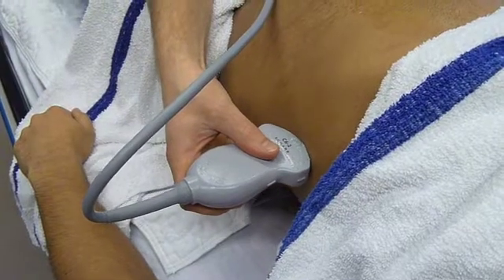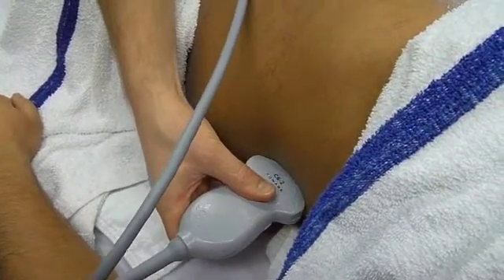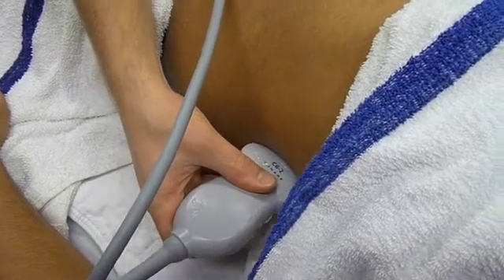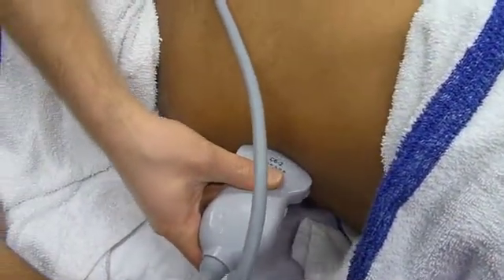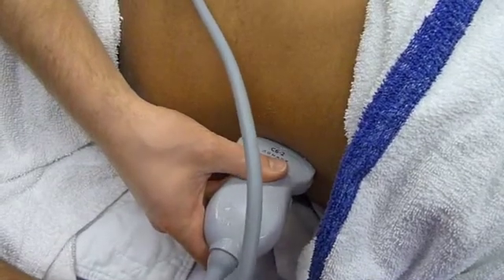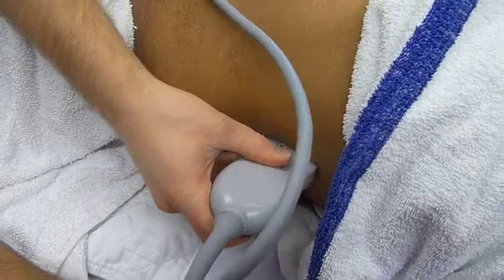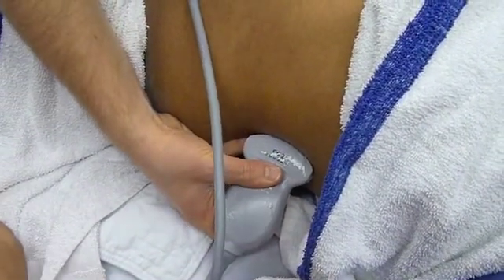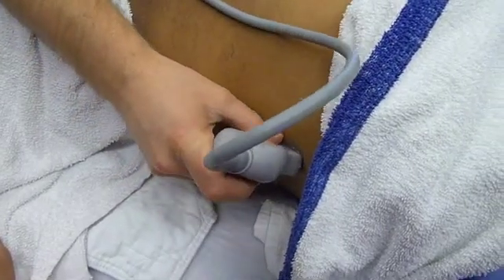Now let's do the left upper quadrant. The procedure is basically the same. Here I'm making my AP move until I get the largest possible view of the kidney I can get. Now I'm making my longitudinal move to find the interface and the diaphragm. Now I'm sweeping. It's often the case that you can't see the whole interface at once because of the rib shadows, so you'll have to do overlapping sweeps. You also have to sweep the diaphragm.